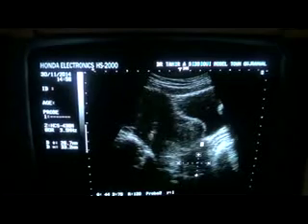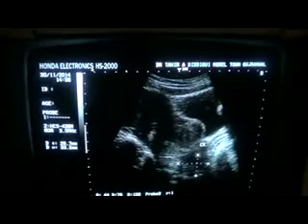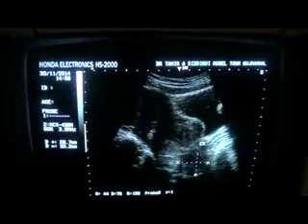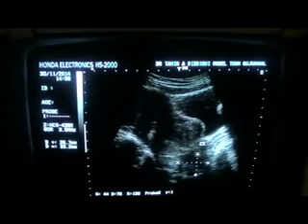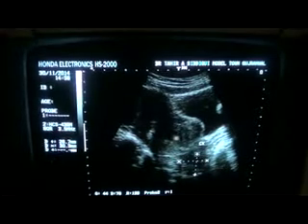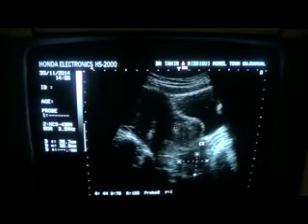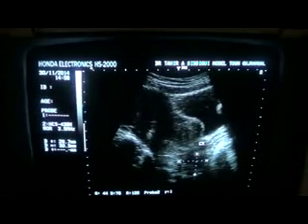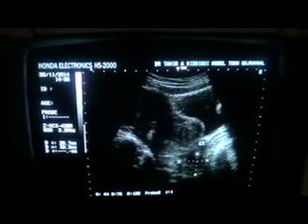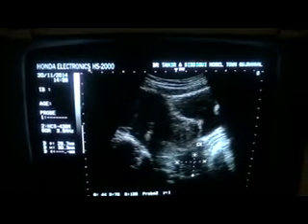This is the cervix, this is the vagina, and there is another mass seen. Now the cervical fibroid measures approximately 30 by 26 mm, whereas this one, this area, is hypoechoic, and this is extending posteriorly from the posterior lip of the cervix, and this one is indenting into the wall of the urinary bladder.